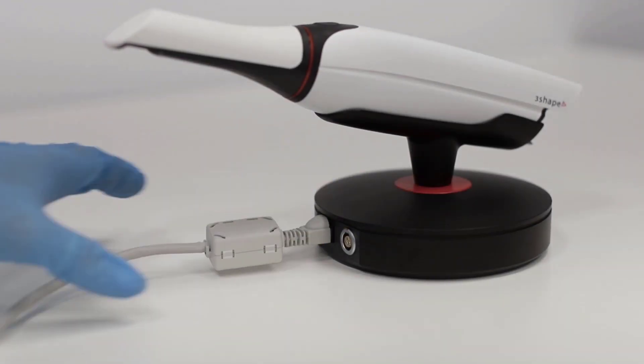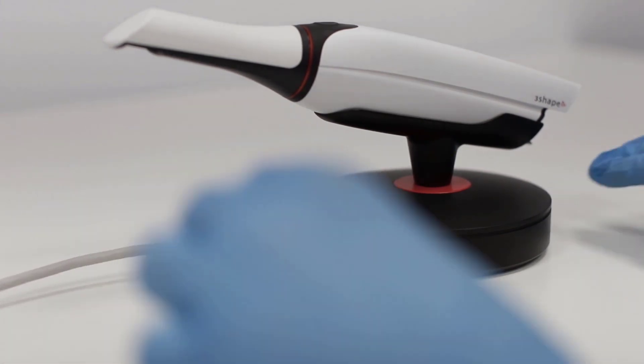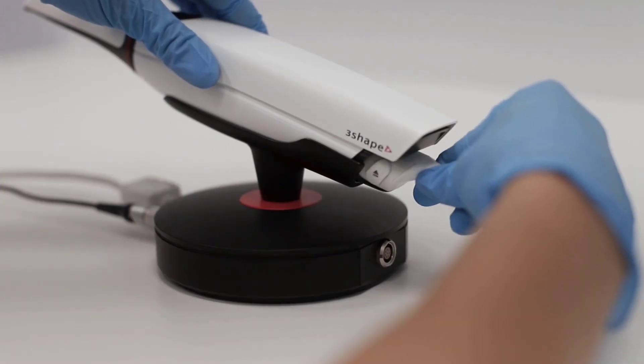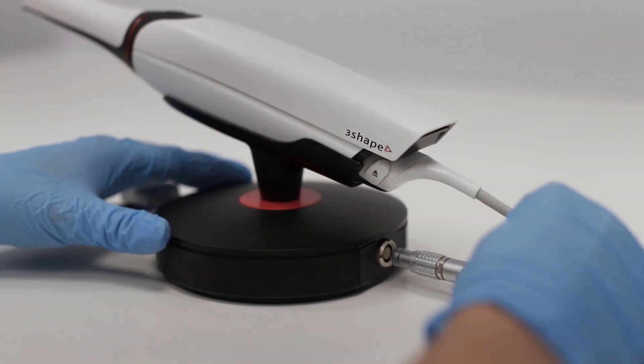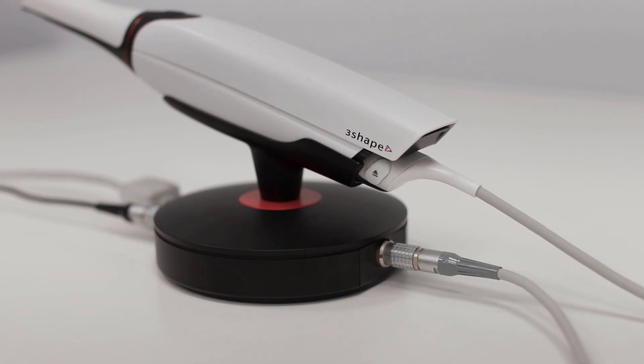Each cable fits into a single connection. Ensure that the red dot is pointing upwards. Remember that during the connection, do not force any plugs — press only very gently. If something doesn't fit, check the wire or the port.